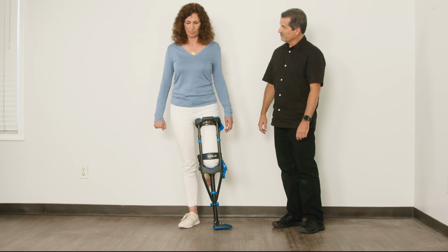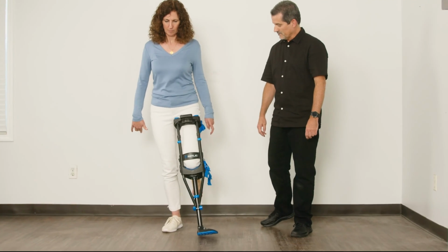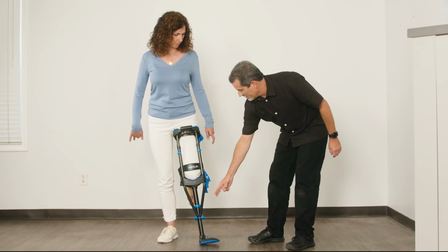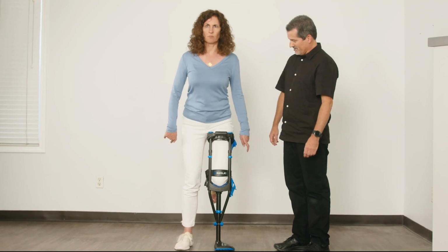The wedding march. This condition happens when the patient takes half steps with their good leg, so that their good foot lands side by side with the crutch foot. It looks like they are limping. It's easy to spot and easy to correct.